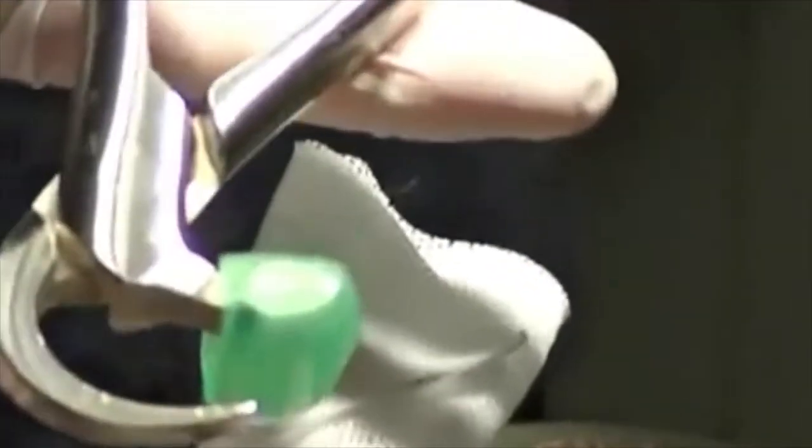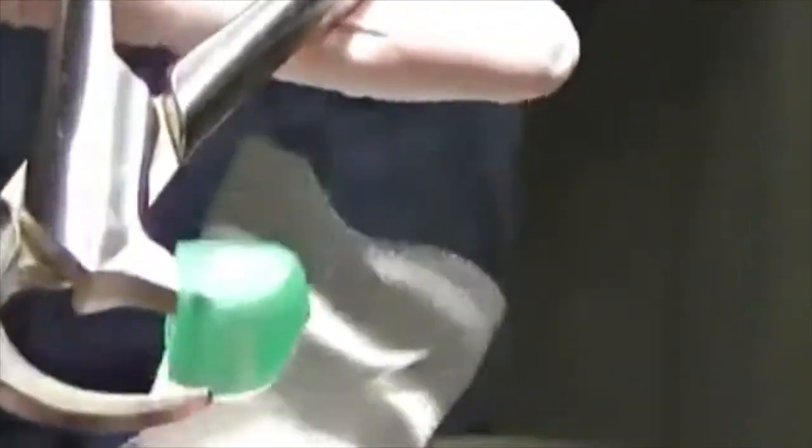Now we're going to remove the mandibular teeth from first bicuspid to first bicuspid. We have one universal mandibular forcep — a lower forcep — with a beak that engages the lingual surface of the teeth and a bumper that will engage the buccal vestibule.